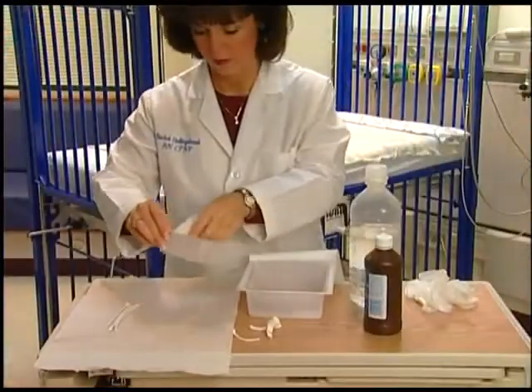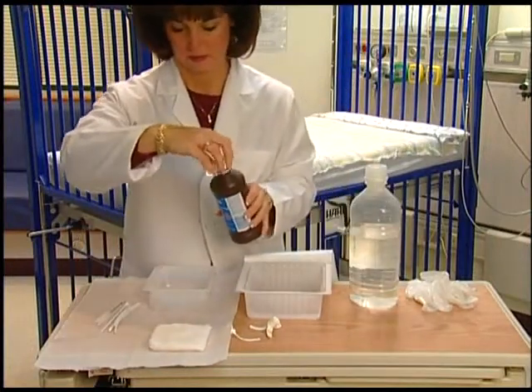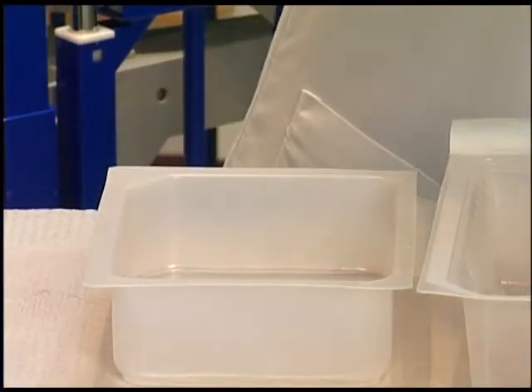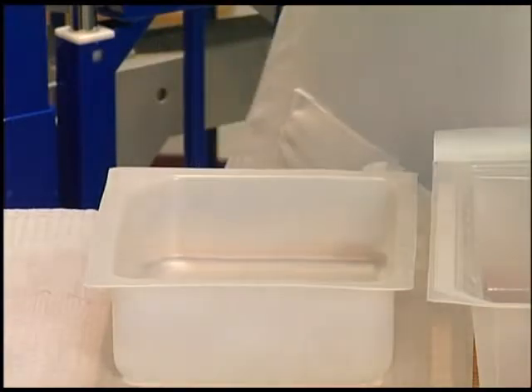After the tracheostomy tube is changed, your healthcare team may instruct you to clean the tracheostomy tube and obturator for reuse later. The tube and obturator may be cleaned using either half-strength hydrogen peroxide, half-strength vinegar, sterile normal saline, or mild detergent.